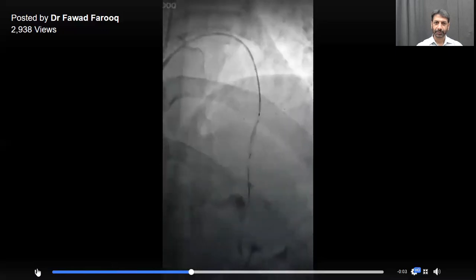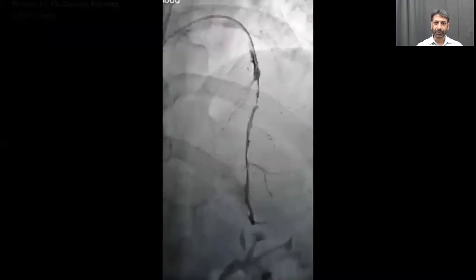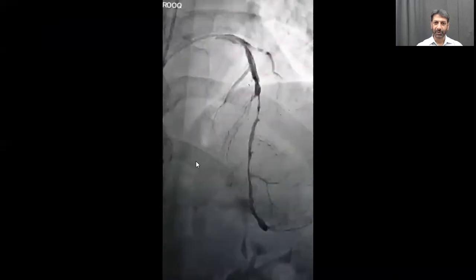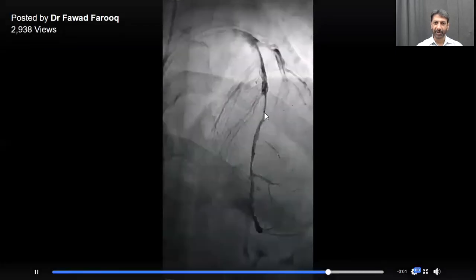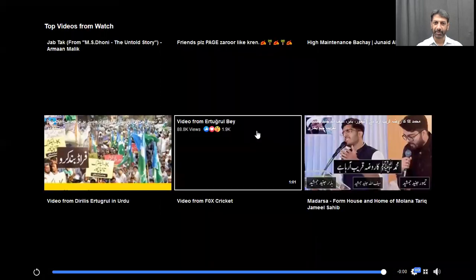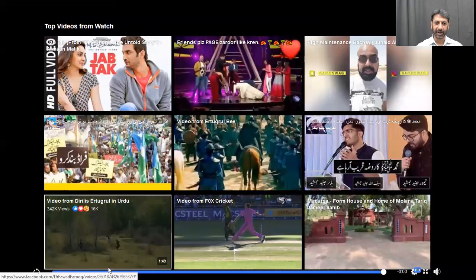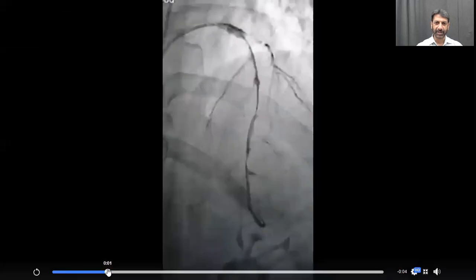And now we can decide from where to where we have to put in a stent. Here you see — the dye is coming from here and we are able to identify what should actually be the stenting site.